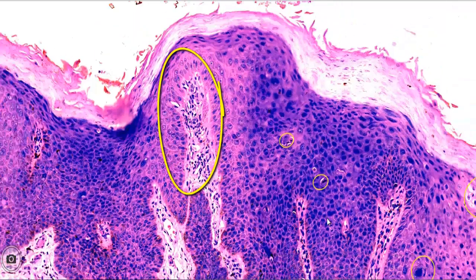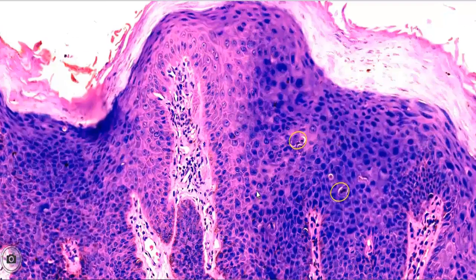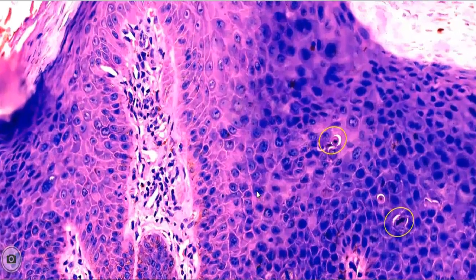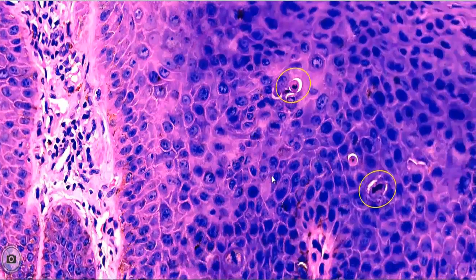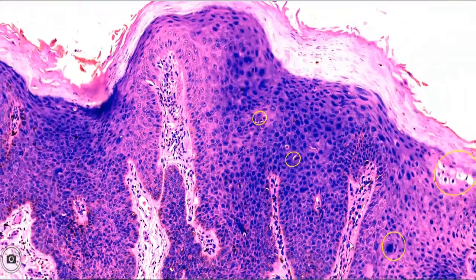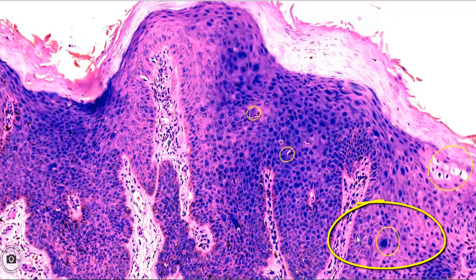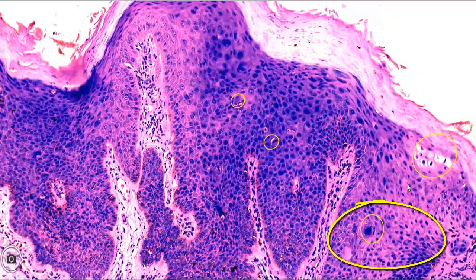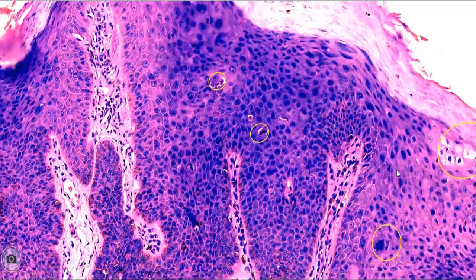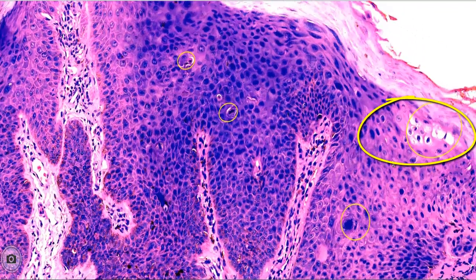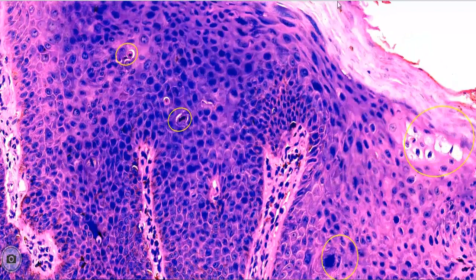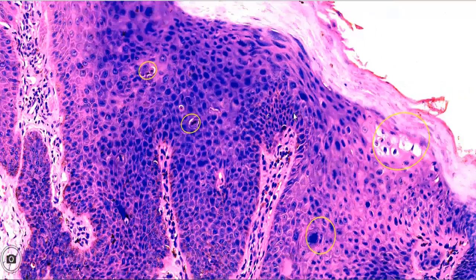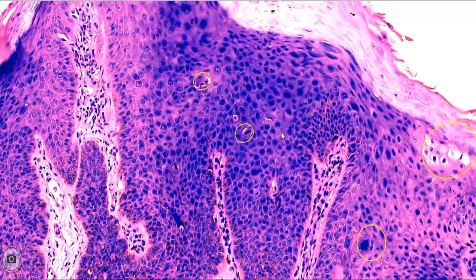High magnification shows cellular crowding, high nucleocytoplasmic ratio, anisonucleosis, and pleomorphism more clearly. One bizarre nucleus can be noted, highlighted by a circle. Another circle shows koilocytosis of a few cells as evidence of HPV infection. Overlying parakeratosis is more prominent.